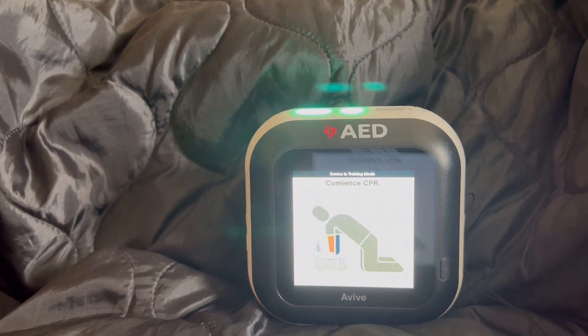Ahora es seguro tocar al paciente. Comience el CPR. Coloque ambas manos sobre el centro del pecho del paciente. Si el paciente es menor de 8 años, use solo una mano para compresiones. Comience con presiones rápidas y fuertes siguiendo el ritmo. Presione, presione, presione.